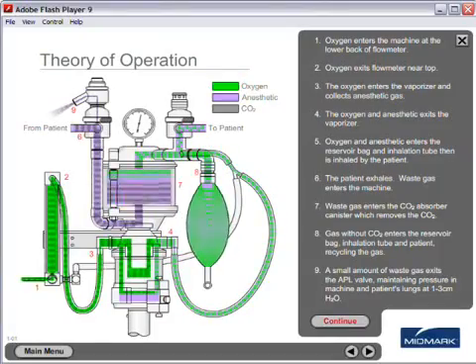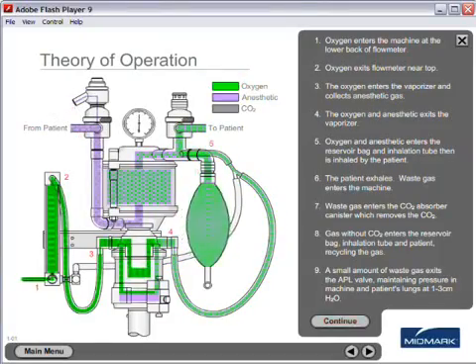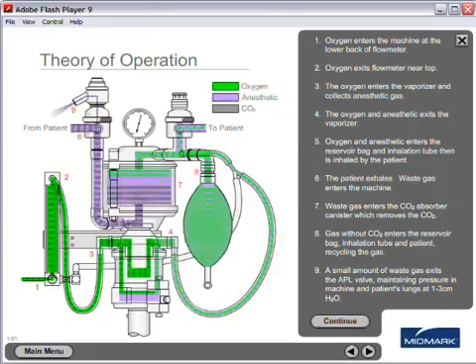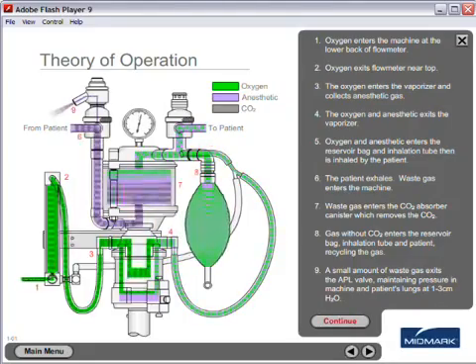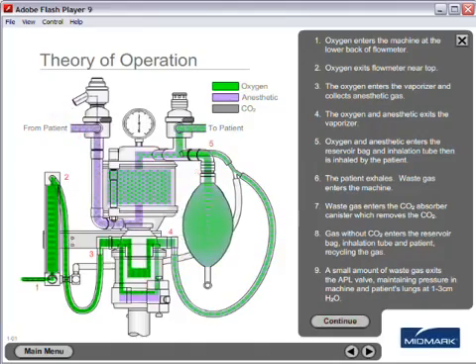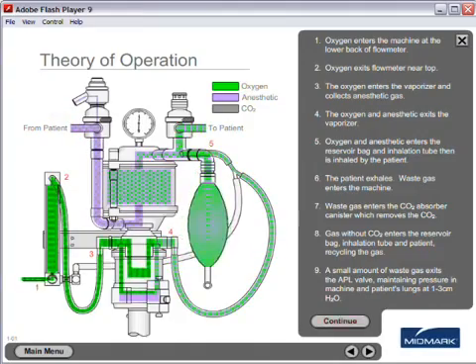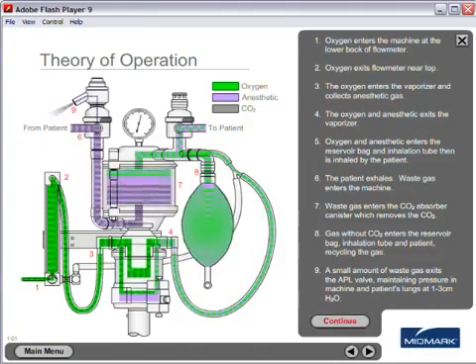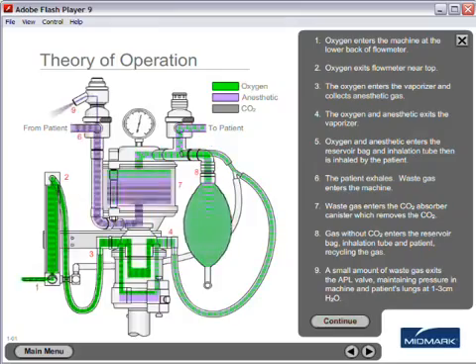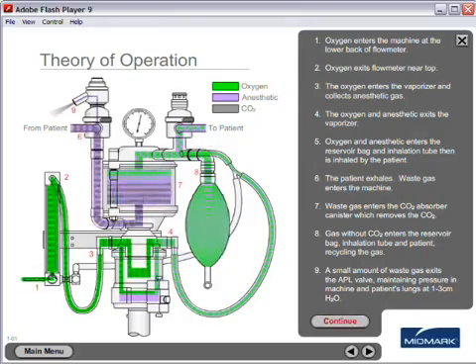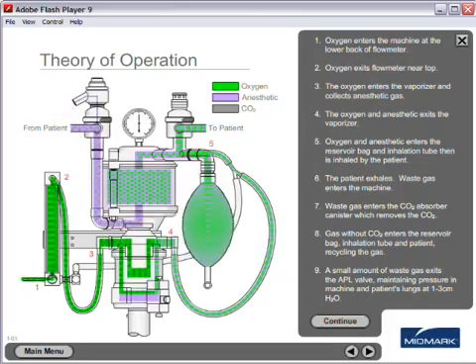Theory of operation. Number one, oxygen enters the machine at the lower back of the flow meter. Number two, oxygen exits the flow meter near the top. Number three, the oxygen enters the vaporizer and collects anesthetic gas. Number four, the oxygen and anesthetic exits the vaporizer.